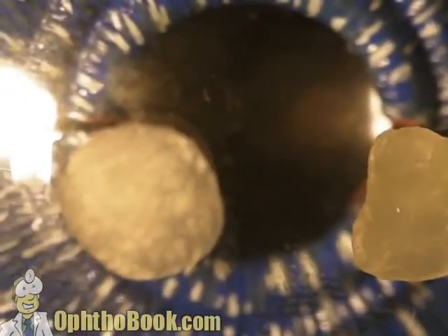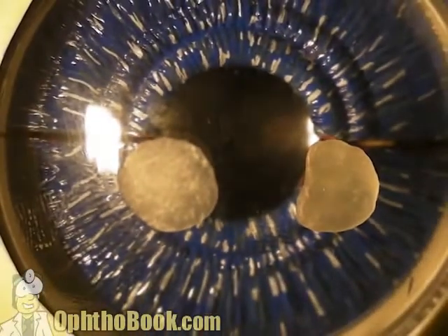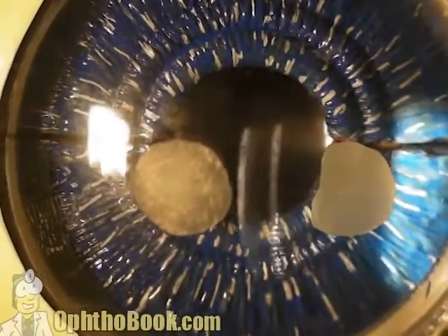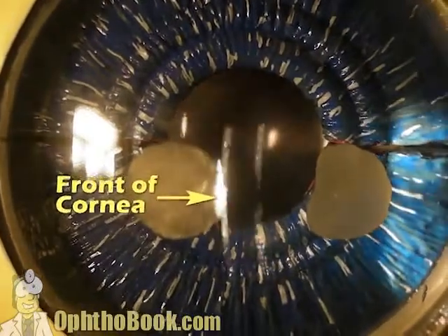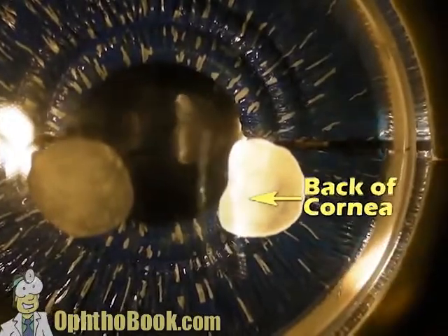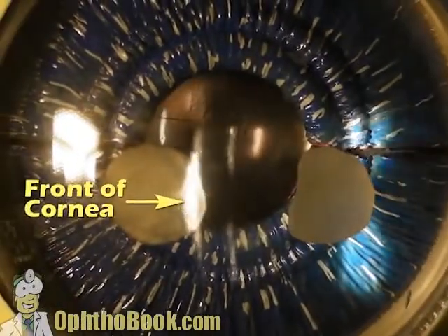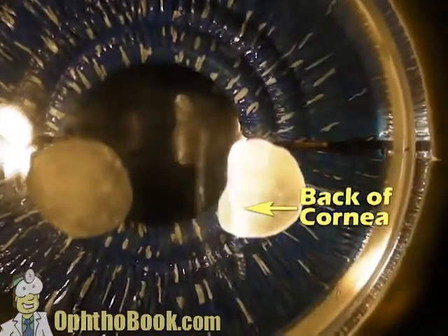Now, I've stuck 2 lesions to this model, but are they on the outside of the cornea? Are they on the inside of the cornea? Well, we can actually use our slit beam to tell. And if we go across, you can see that the front lights up here, and if we go over to the other one, we can see it lights up on the back surface of the cornea. And so a very good way to judge depth and to judge the location of lesions by using our cross-sectional beam. And moving on to the back.